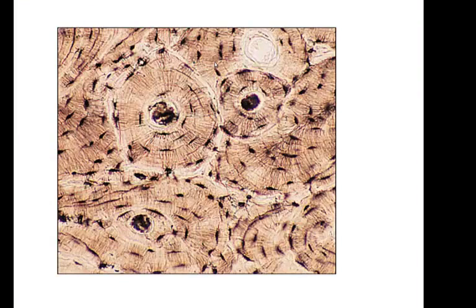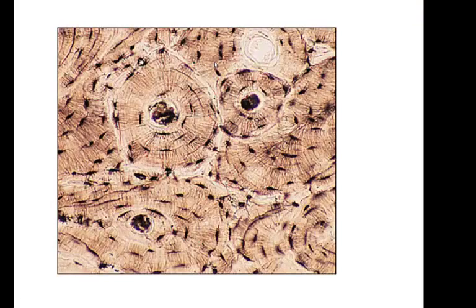Now we're on to the last part of your connective tissue, the other category. This is bone. And bone doesn't look like anything else, so pretty much you should not miss bone. Bone has this nice tree ring structure. Like if you want to see how old a tree is, you look at how many rings it has. This is what compact bone looks like if you take a cross section of it. It has this central region here. This is where you find blood vessels and lymphatic vessels. You have lots of blood inside your bone, by the way, and nerve fibers.